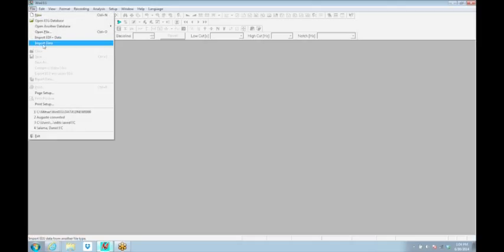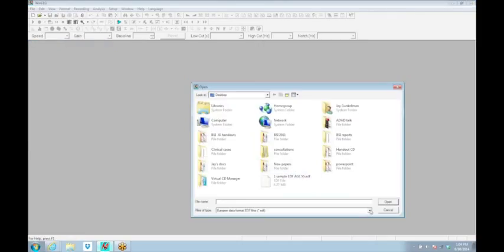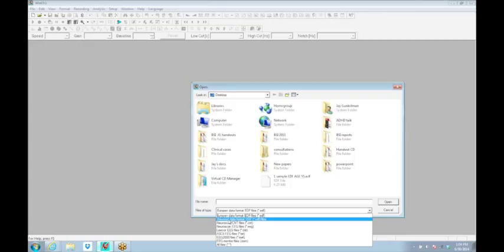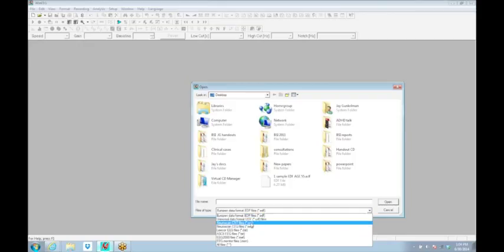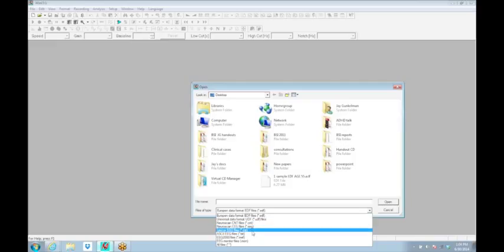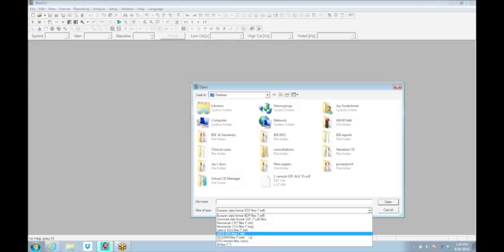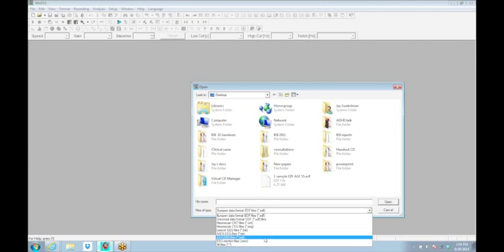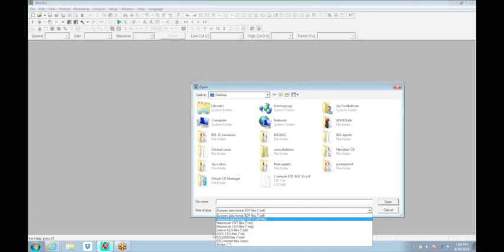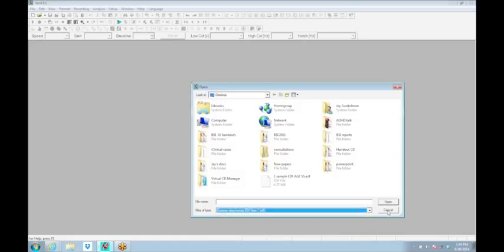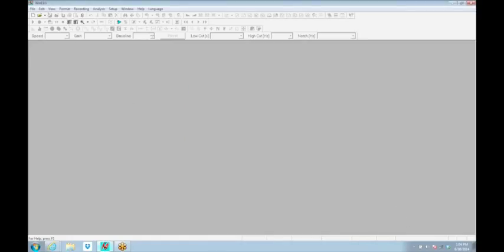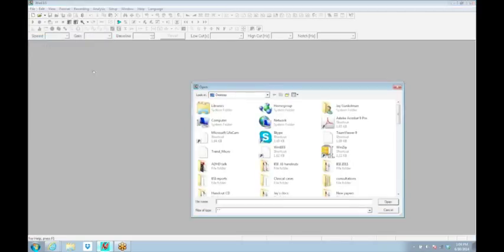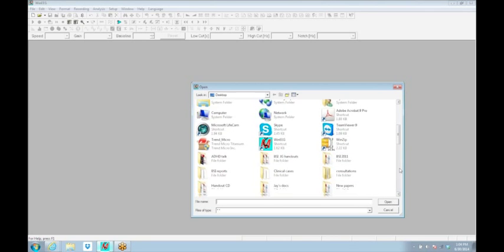The import function allows us to see a wide variety of file types: universal file UDF, CNT which is a NeuroScan file, EEG files, old Lexicor DAT files, ASCII TXT files, EEG 2000, and EEG Monitor files. It also has a more modern import for EDF Plus.